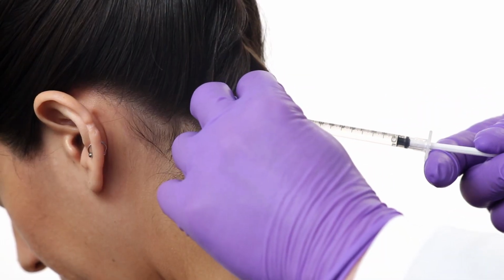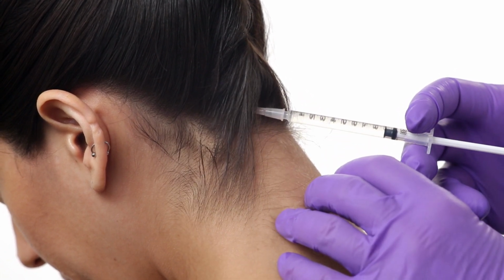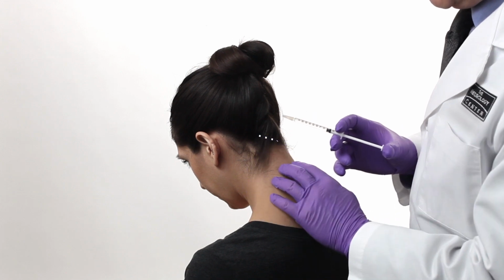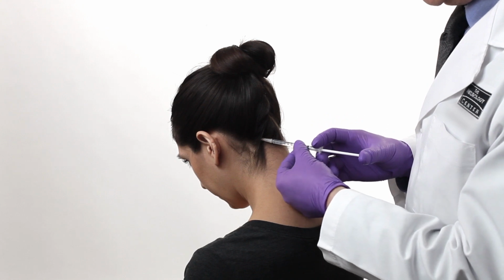With the bevel of the needle facing up, stabilize the hub of the needle and make the injection. Make sure not to go too deep with the needle to avoid neck weakness or pain. For most patients, it is not necessary to insert the 0.5-inch needle all the way to the hub. To find the second injection site, measure approximately 1.5 centimeters, or approximately 1 finger's breadth, diagonally up at a 45-degree angle toward the superior margin of the ear from the first injection.